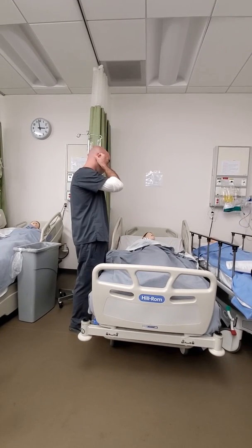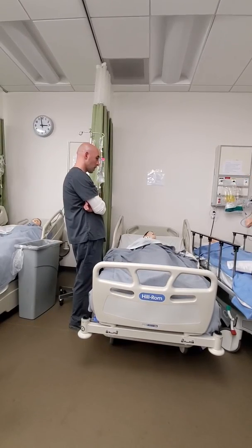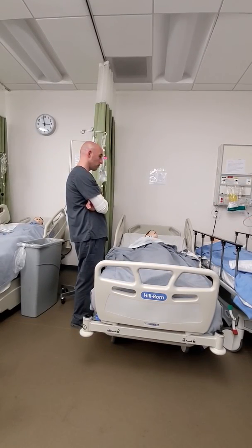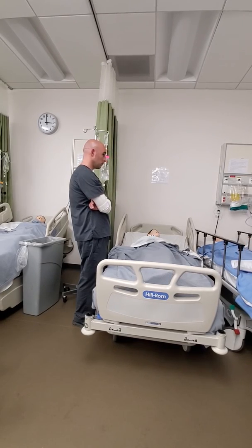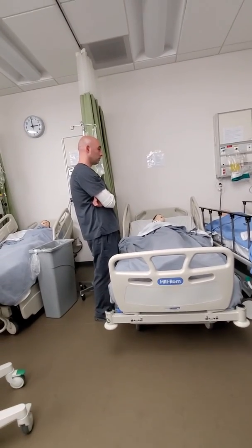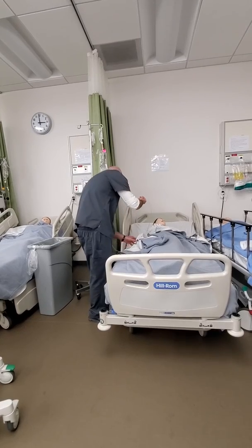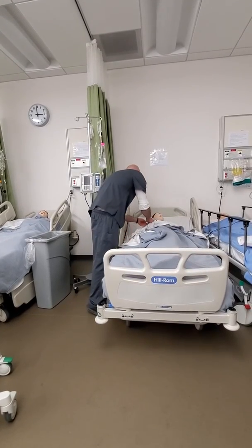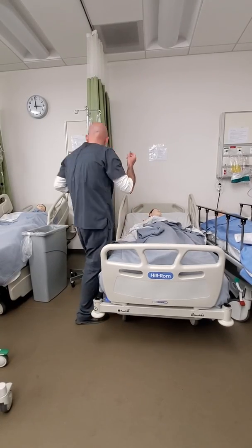Okay. And in here, just feedback that when you do the flush, have your line ready on the bed next to you. Do the flush, push pause, disconnect, and then hook up the line right away. Then it saves steps, right? Then you don't have to go back and clean it again and hook it up later. So this line, just so I don't leak it anywhere. It's not gonna leak. It's in the pump. Yeah, I don't know why I can't remember that.